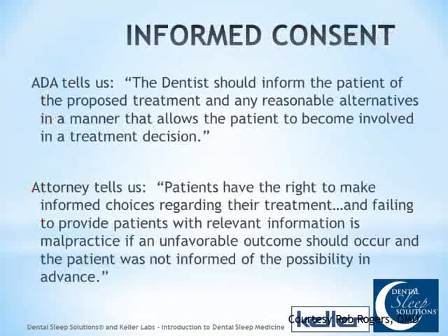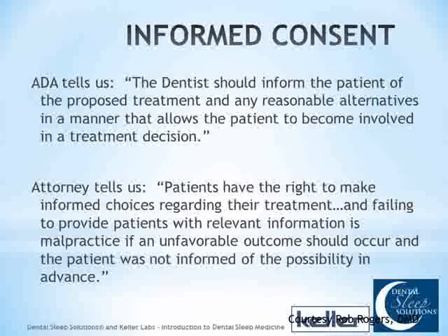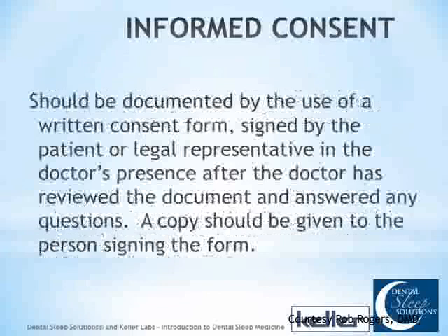And with the informed consent especially, because when we look at doing devices on these people, we're going to move some teeth. And we'll talk some more in our next webinar about managing side effects. But teeth can move, and they do move. So when we think about an informed consent and what we need to tell the patient, we want to say this is what we want to do. Here are the reasonable alternatives to that.